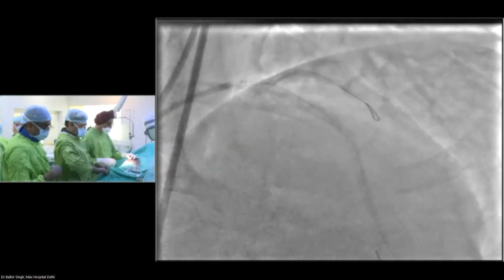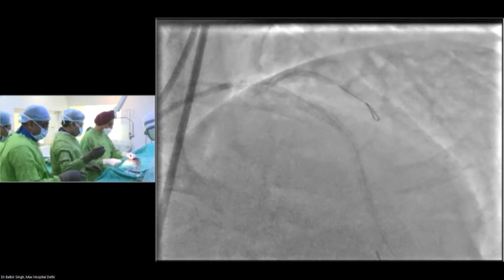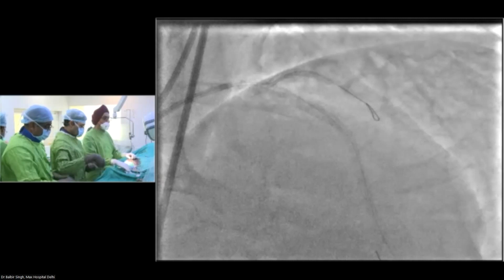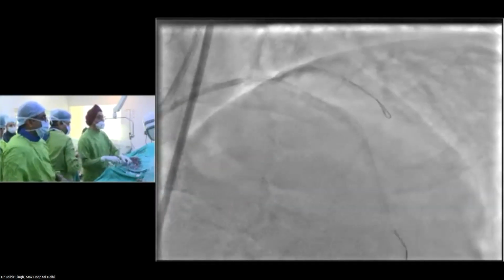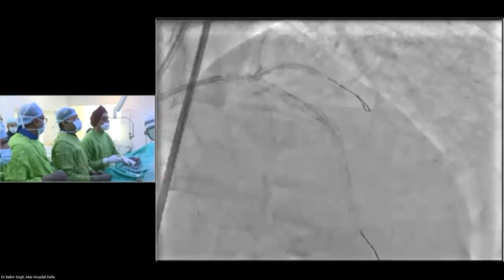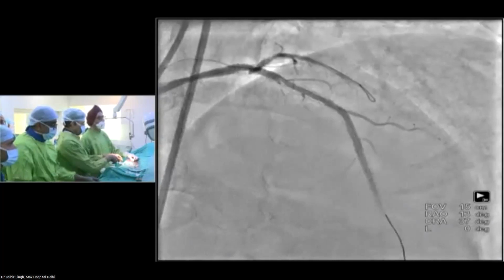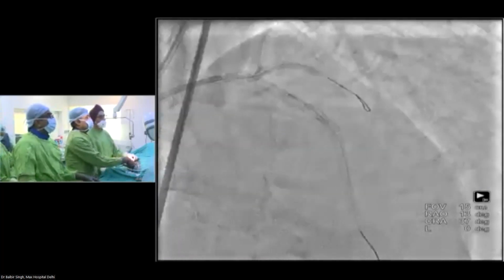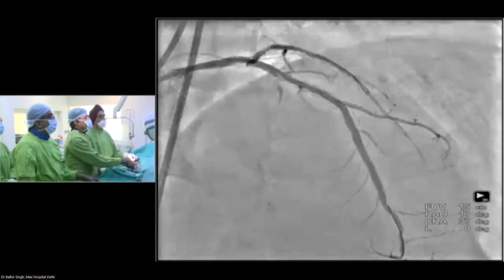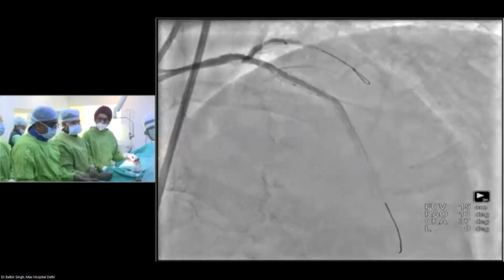I know that the other option was to use a long drug-eluting balloon for the distal LAD, but I wasn't too sure about that. The in-stent restenosis definitely is a neoatherosclerosis, so we need another stent. Now it looks much, much better, but however, you need now aggressive post-dilatation with probably a 3.5 NC balloon in the proximal LAD. Right, 3.5 by 33 stent.